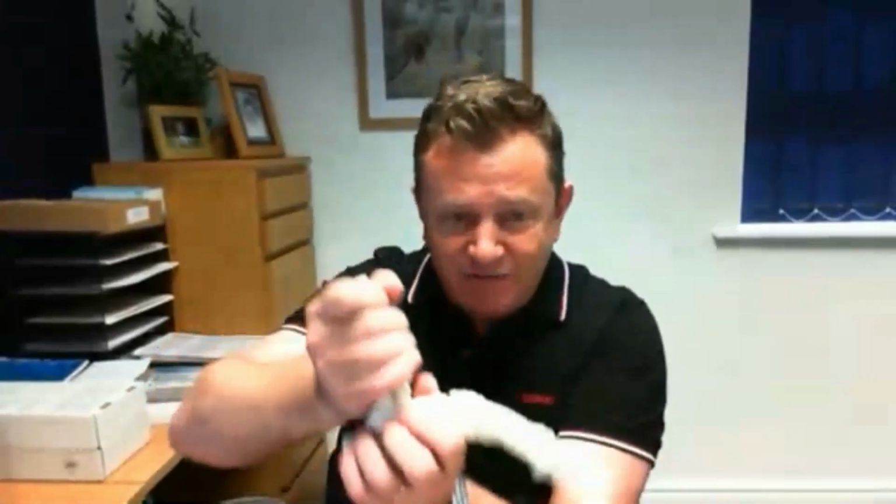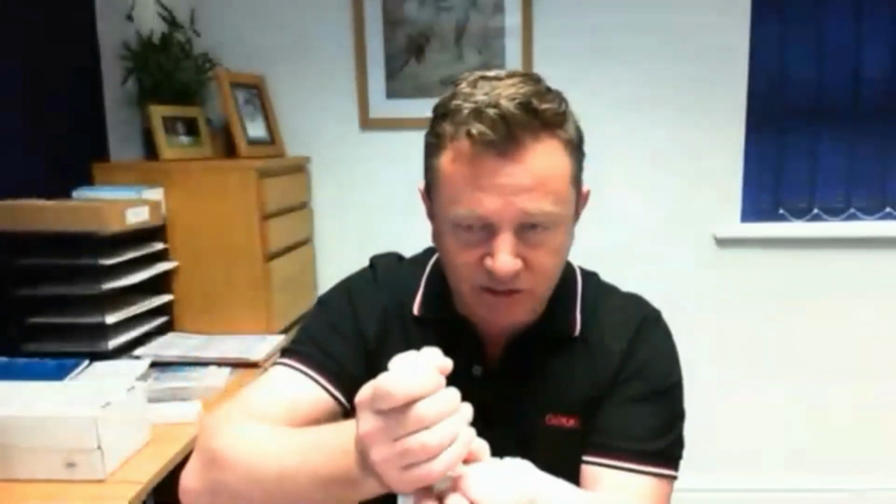When we're dealing with AFOs, we've got a slightly different scenario, because we're providing a patient with an AFO for one of two reasons mainly. One is pain. So we've now got a massive amount of evidence that offloading AFOs, things like the momentum, some of the carbon stuff going back to the Sarmiento AFO, can reduce the axial load, the compressive force through damaged joints for trauma patients and patients who have all sorts of arthritic degenerative conditions in their feet.